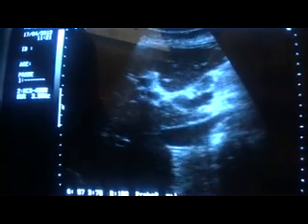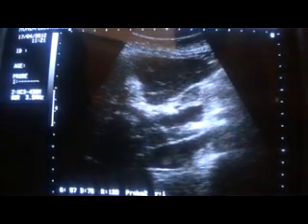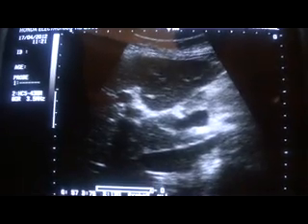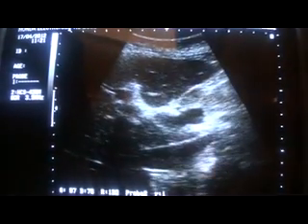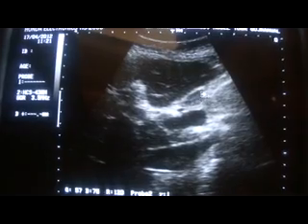This video is explained to the study of rounded, well-demarcated hypoechoic solid lesion. This is the well-demarcated hypoechoic area inferior to the portal vein. This is the hepatic hypoechoic cross-section. This is the inferior vena cava, and this is the liver. Now this is a lymph node at the region of porta hepatis.